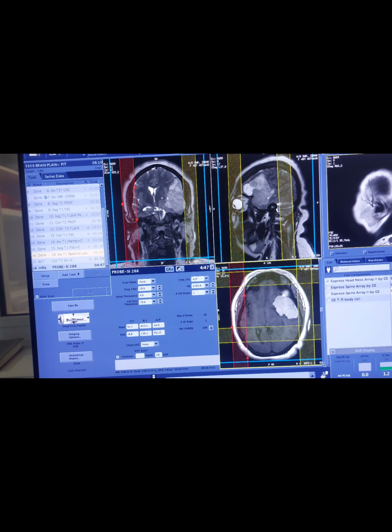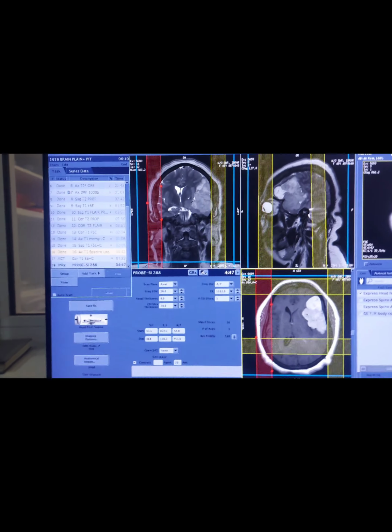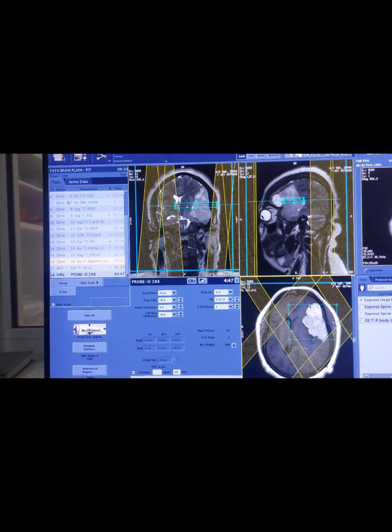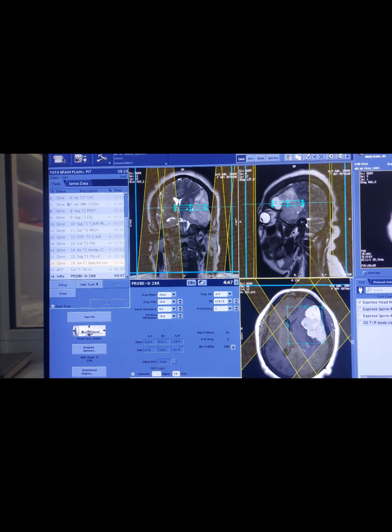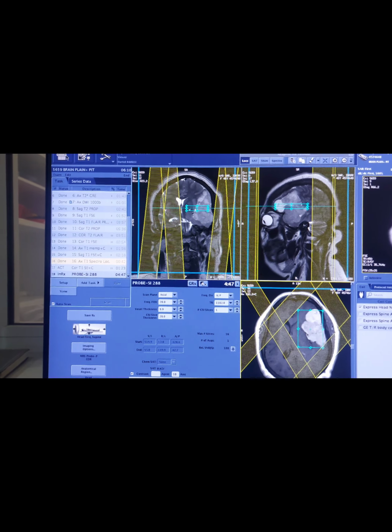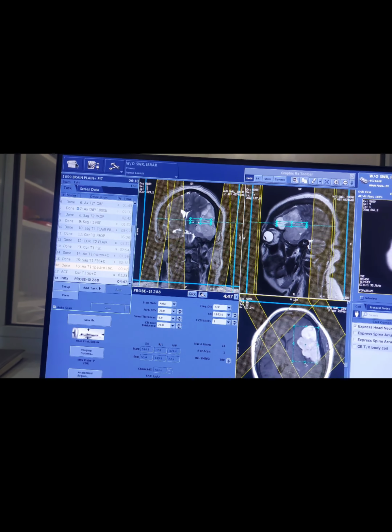First we will decide our image of interest where the lesion is visualized very well. So I guess this is the right image. This blue box is for the spectroscopy box. This will cover the whole lesion like this. We will avoid air, water or fluid and bone in the spectroscopy box, and we can arrange the size according to the lesion as well.